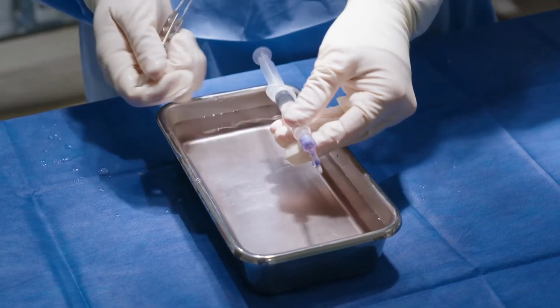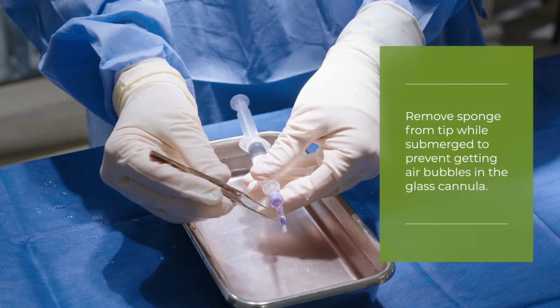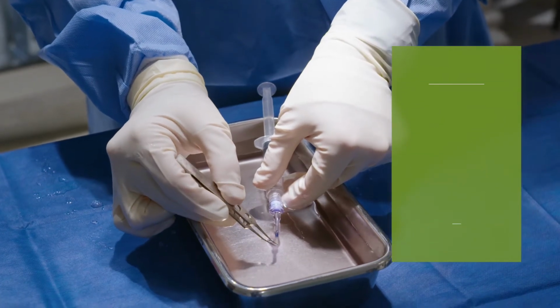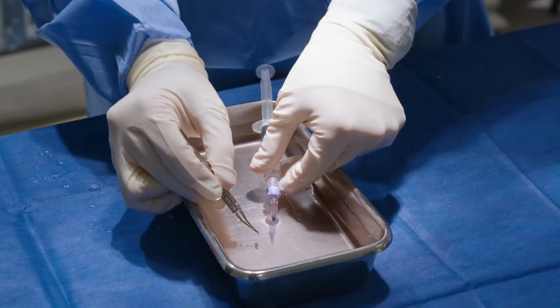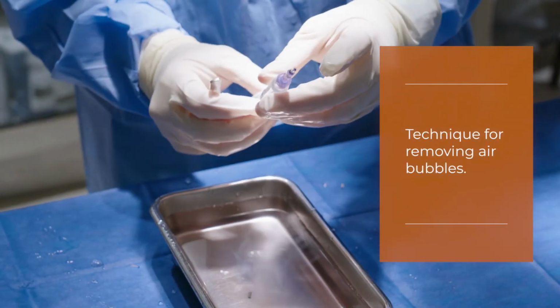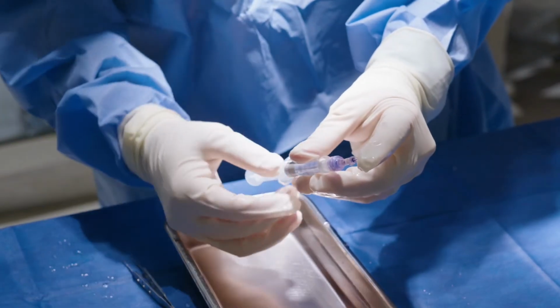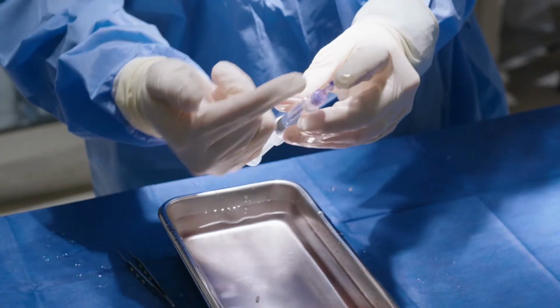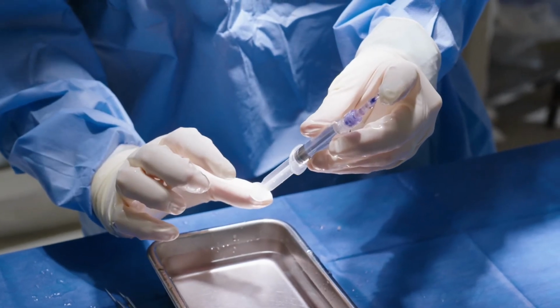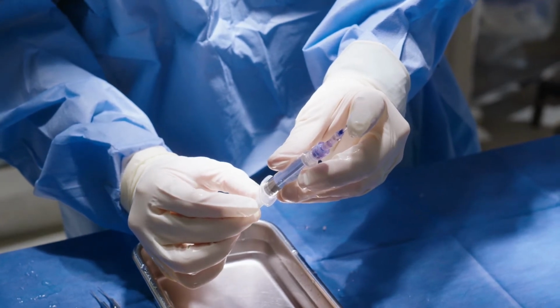So the final step before I bring the transplant tissue over to the patient is I remove the cotton at the tip of the glass cannula. Now I do this submerged in BSS. This ensures that no bubbles enter the end of the cannula. And if there were some bubbles or if there's air at the end, what you'd want to do is put your finger on the top of the glass cannula here and gently bring some BSS forward with the whole cannula and the whole device facing upwards. And I do it not by pressing on the plunger because that's too rough and too abrupt. I do it by gently moving this up here.